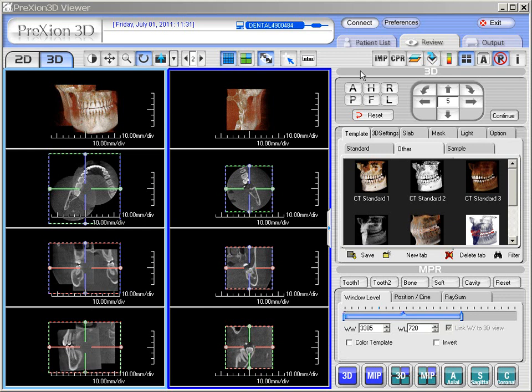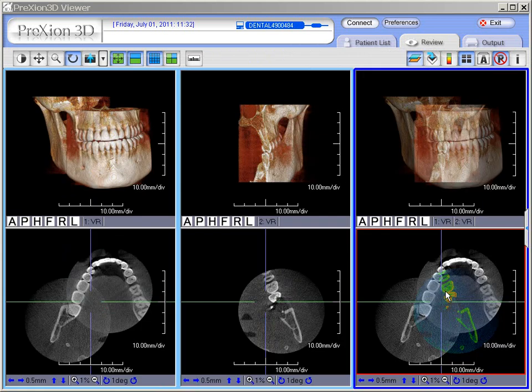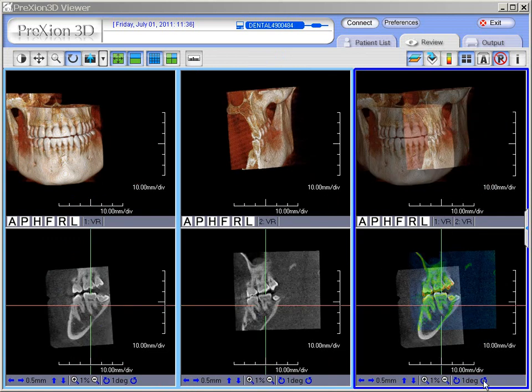Pretty much the same steps here: click the fusion tab, fusion loads, then left-click and drag data set 2 over data set 1. Don't worry about perfection at this point — just generally get it lined up. Do the same for coronal, make your adjustments or rotations. Same for the sagittal screen — double left-click, load it by itself. Slice to find the area of overlap, right-click, go back to the smaller screen and use the registration — rotate, translate — and make the adjustments until one is fully satisfied.